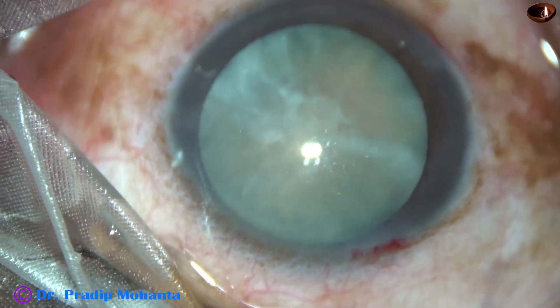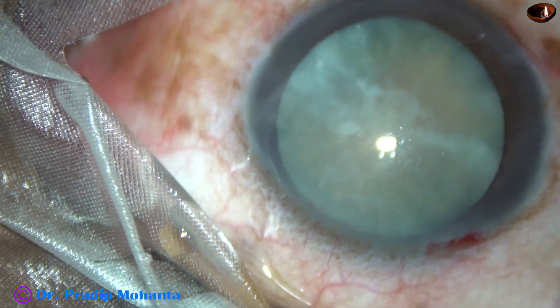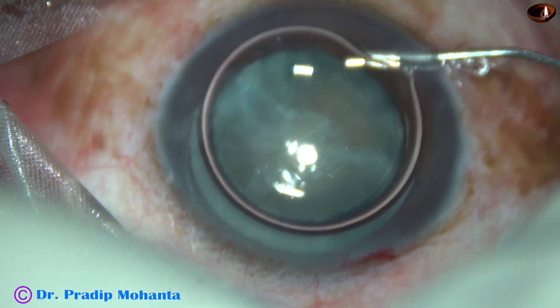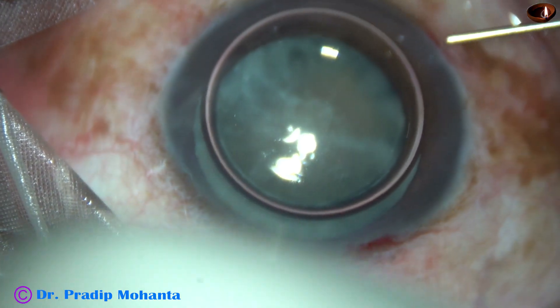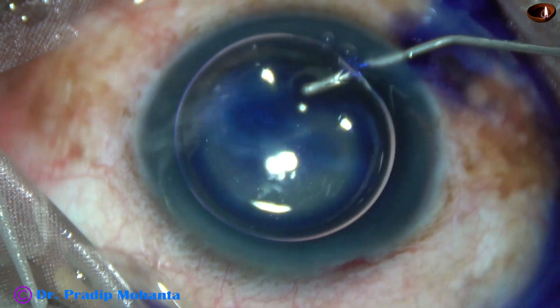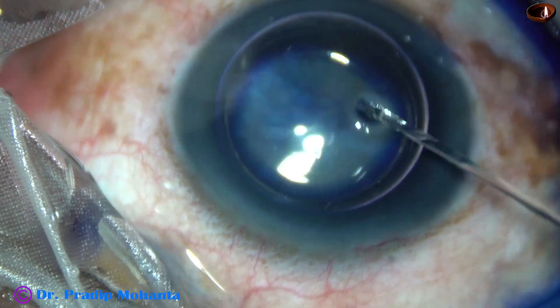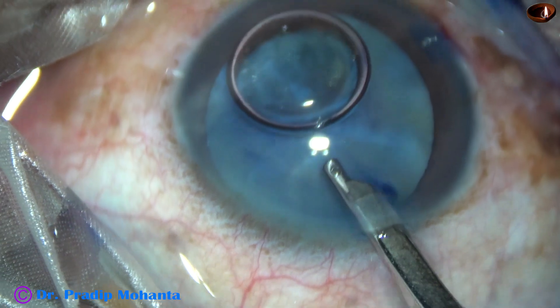The anterior capsule is to be stained with trypan blue dye. I always use an air bubble to fill the anterior chamber, and under this air bubble the trypan blue dye is applied. The advantage is the dye is undiluted by the aqueous and it stains the anterior capsule very fast.